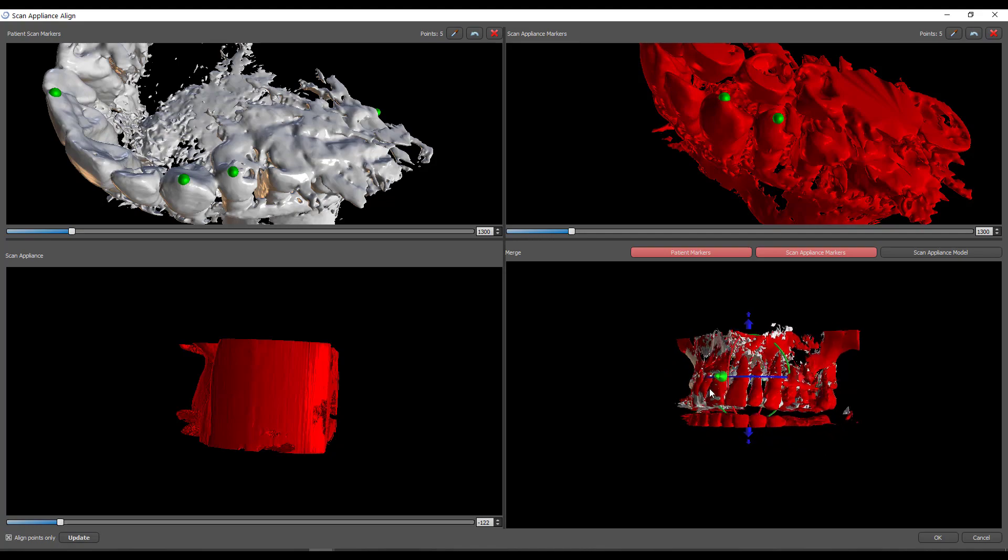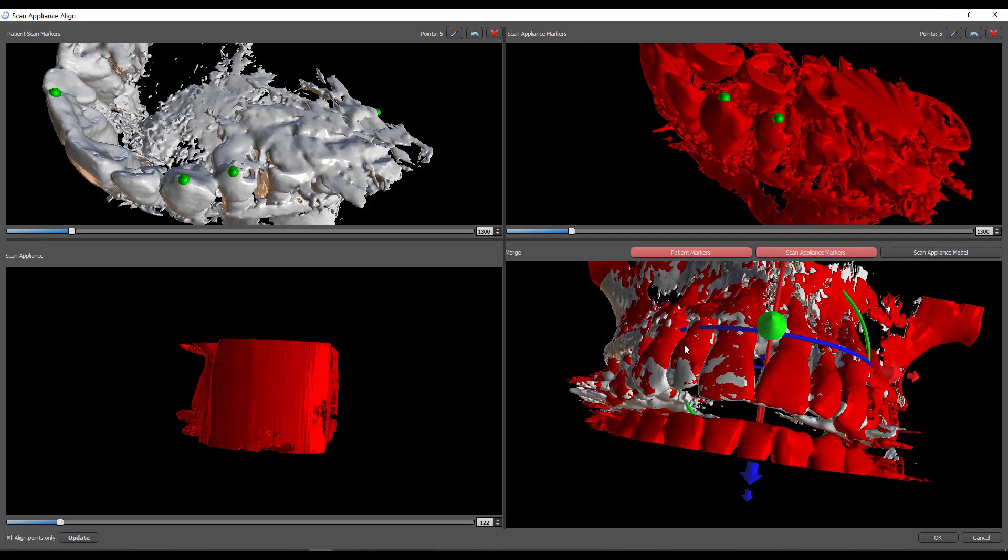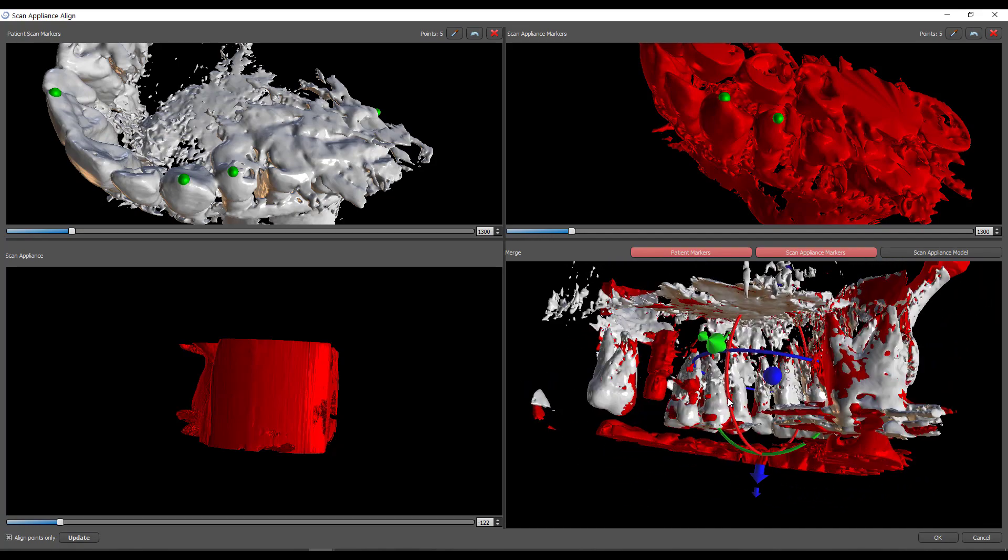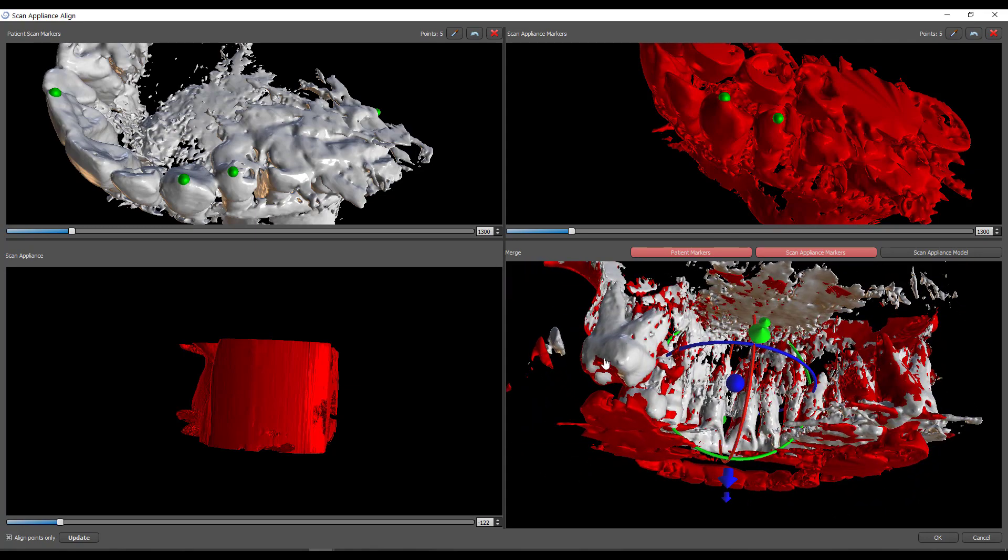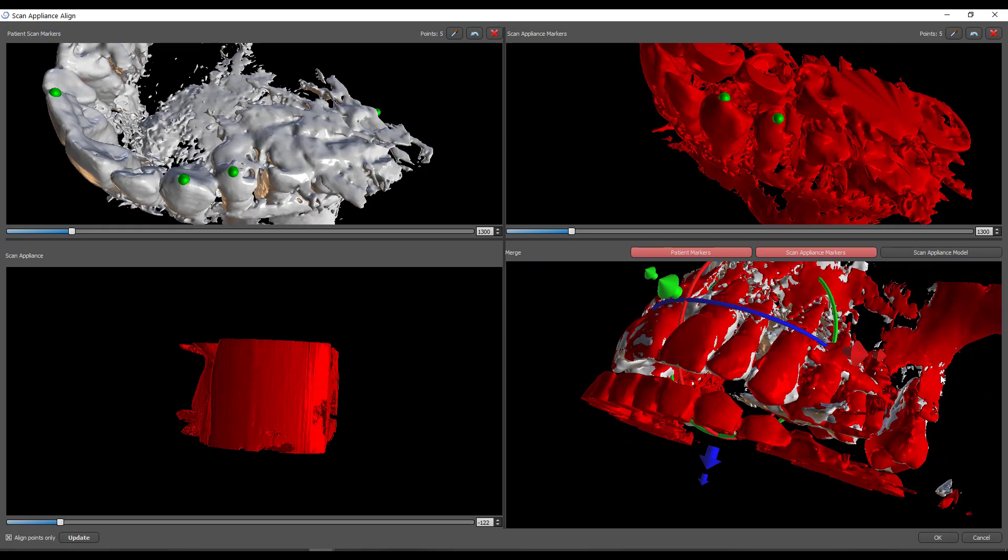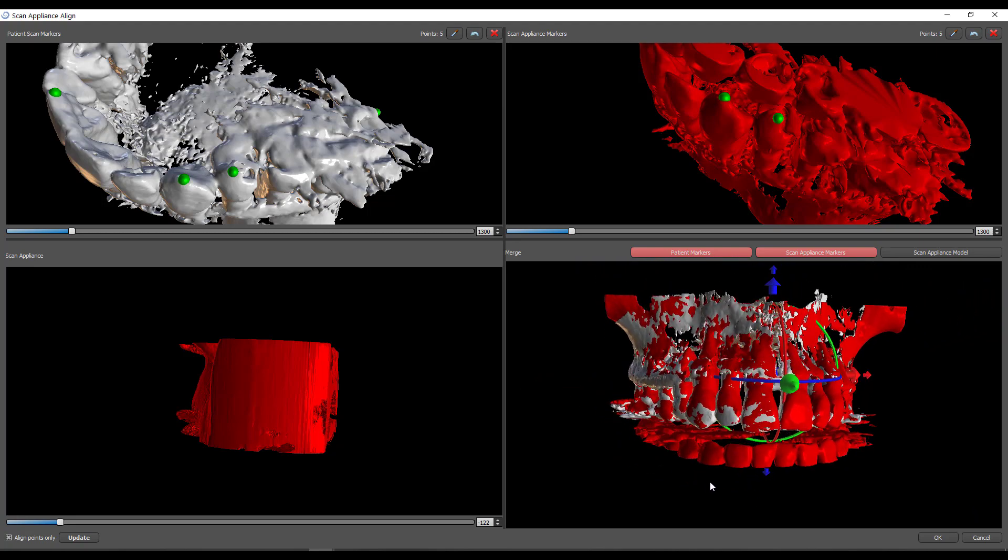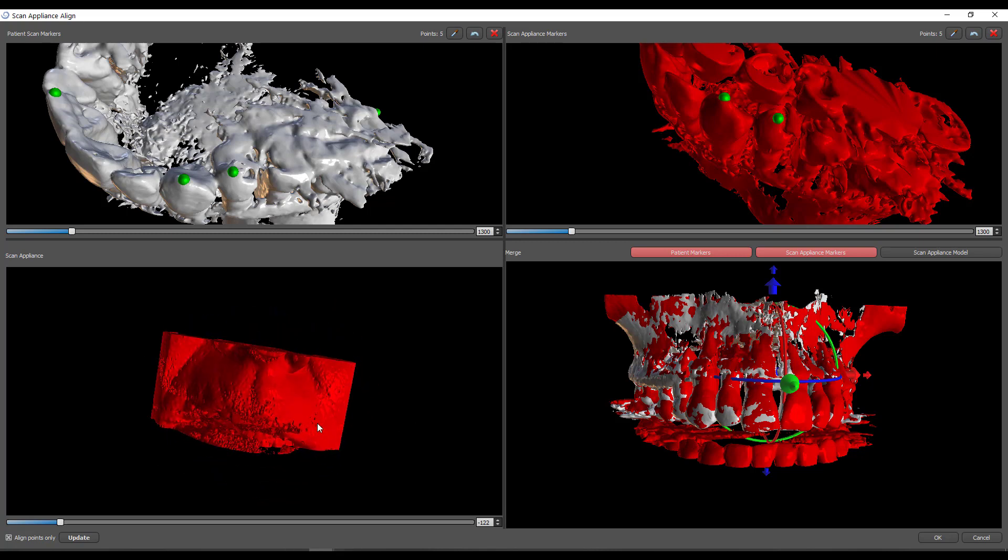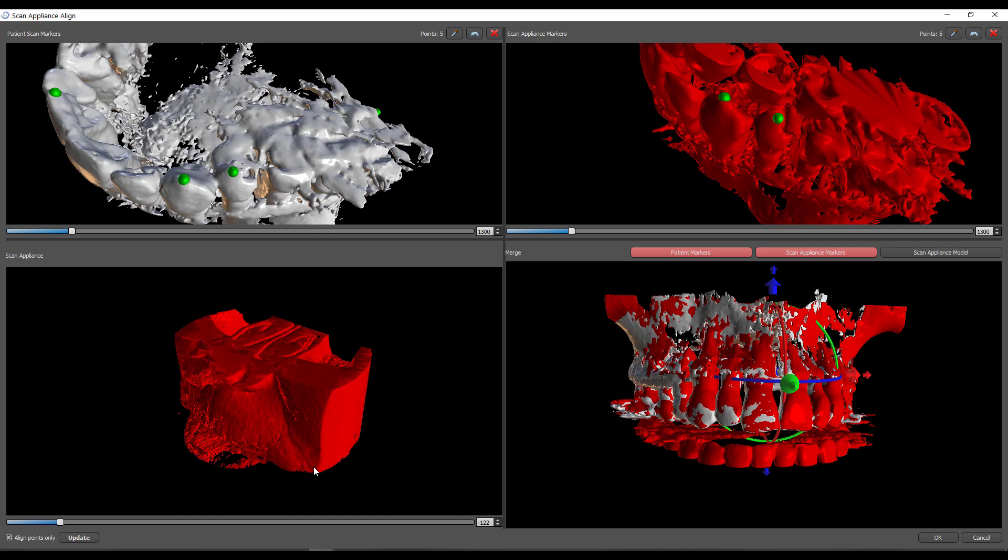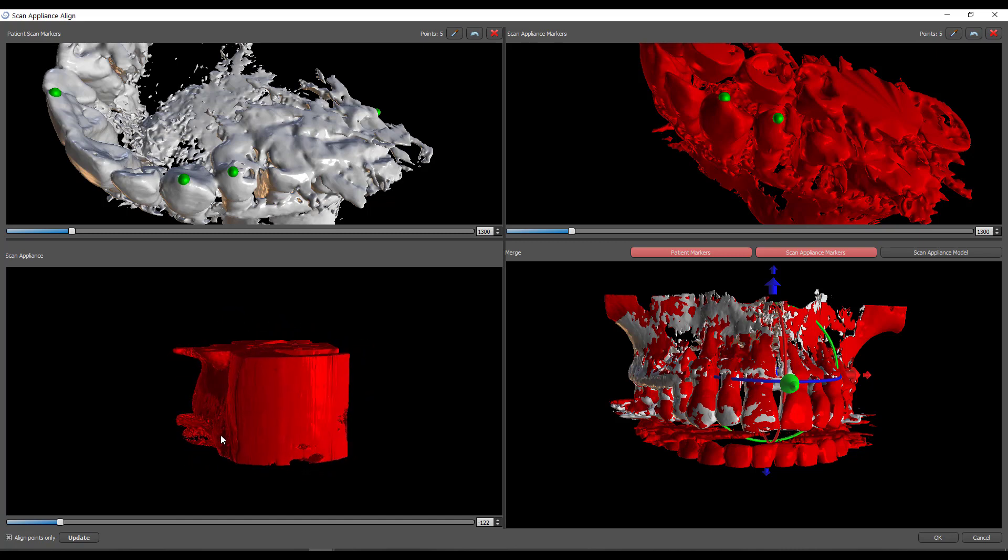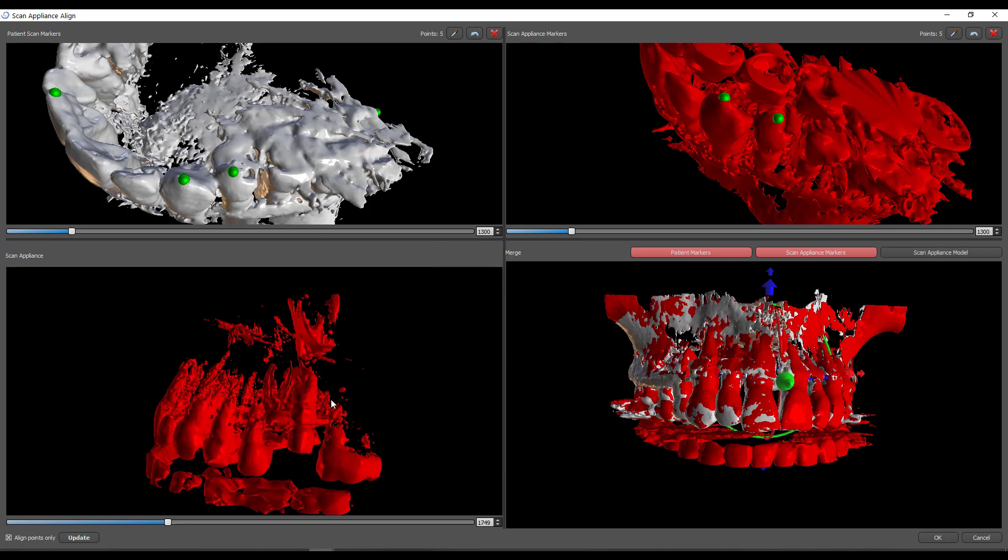And now hopefully you can see in the bottom right-hand screen that these are very closely superimposed over one another. You can see how the colors bleed through one another on all different sides, not just from one side or the other. So I'm confident in my stitch now. And that's important. We've got to get that right. Otherwise, this whole process doesn't work. Now, the last step in a typical dual scan of a scan appliance, this bottom left window, again, represents the denture. And you would want it the full volume because it needs to make a solid STL. Again, we're hacking this. We don't want that. What I would like to do here is raise this slider up to the point where that implant appears very clearly.